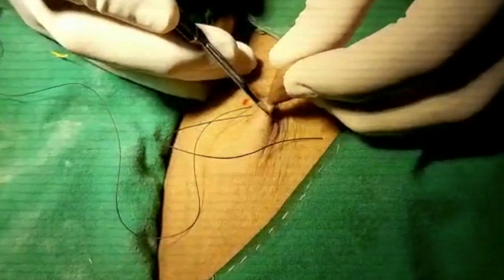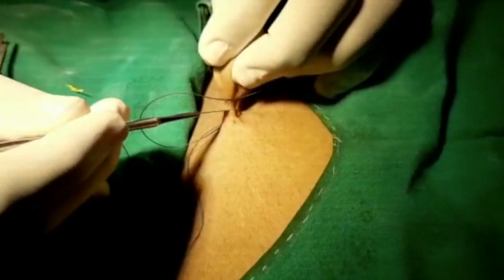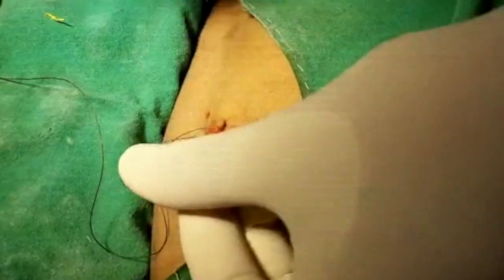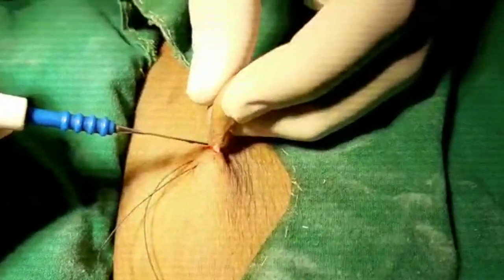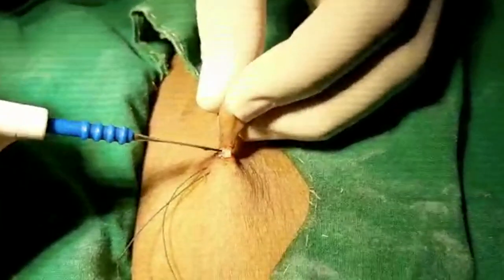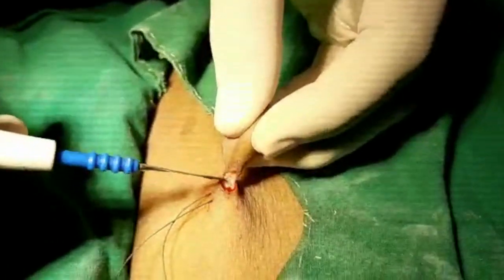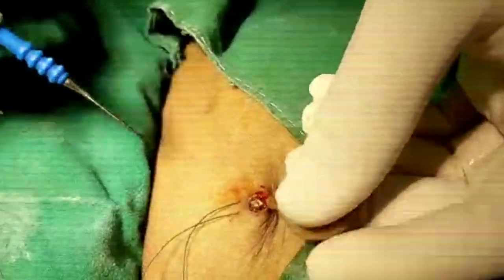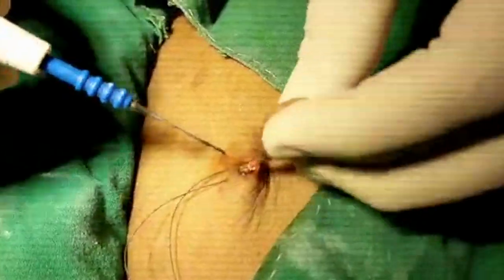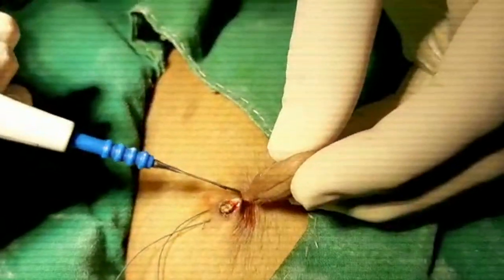Give a small incision at the base like this. Now we will be excising the mass — start from here. There is no significant bleeding, and the mass is excised.